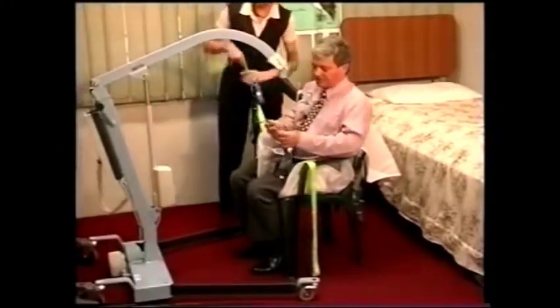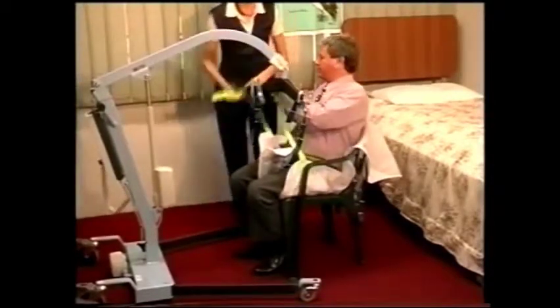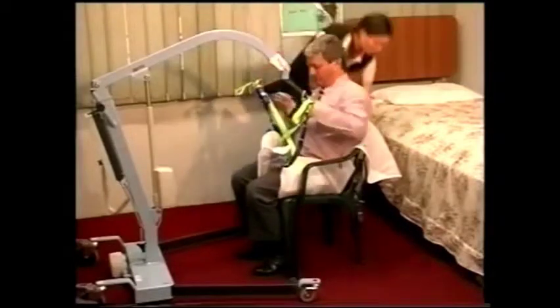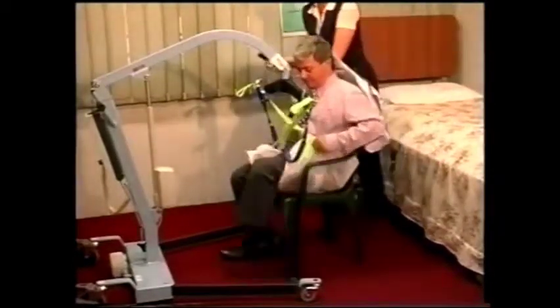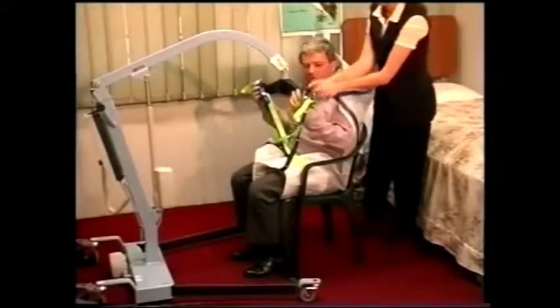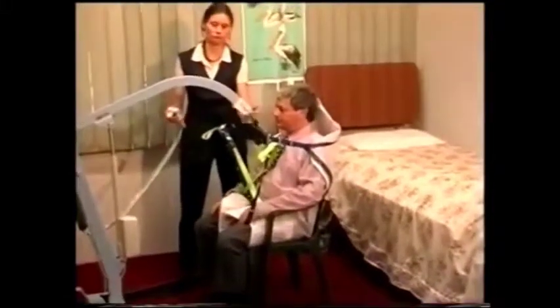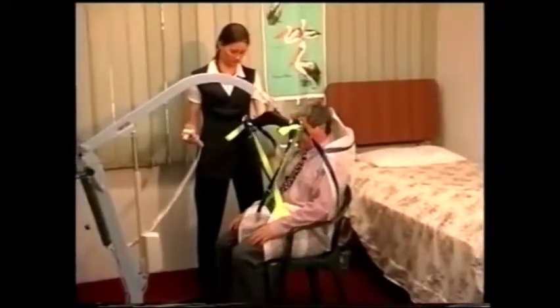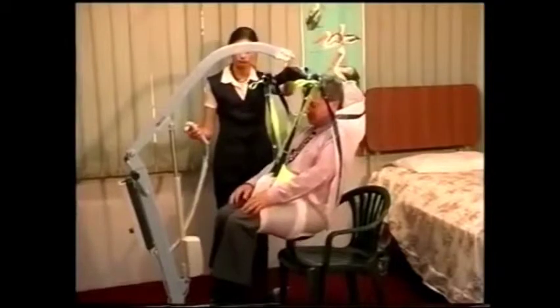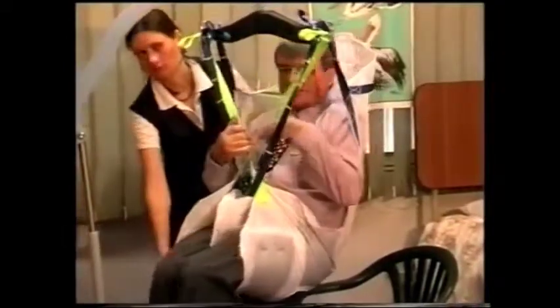Third one down on the legs, and third one are crossed over on the green ones. And second one on the back there. Right, one, two. Pick me up again. That's it. Now this time we've got the outer straps, hip straps here, the green ones, are coming across.